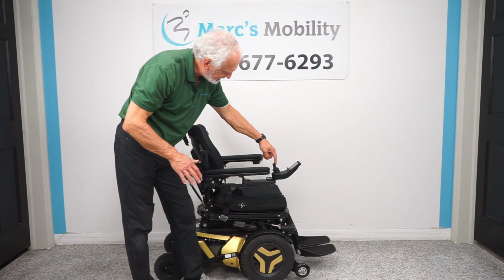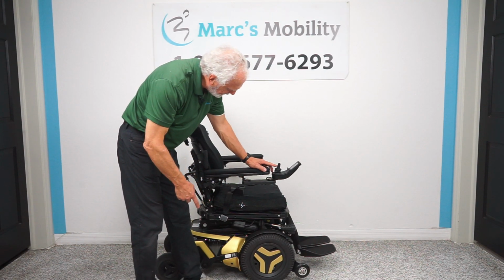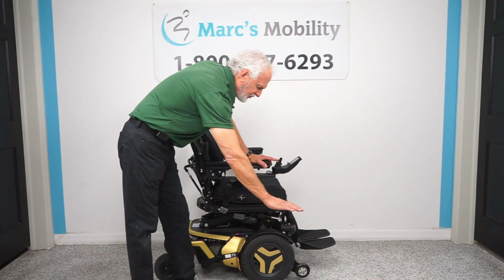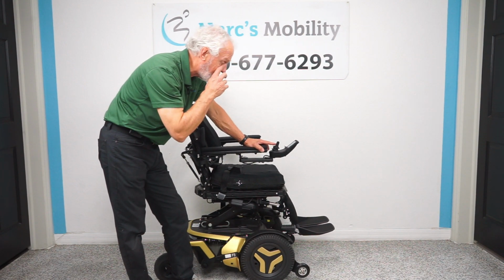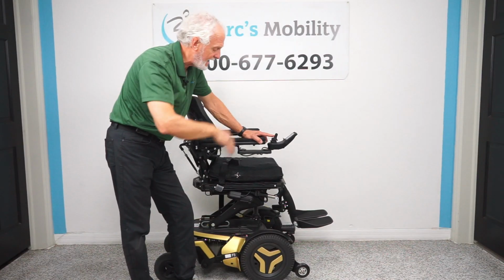So now I'm going to push it back and you'll see the seat start to go up. Well, actually it's forward. And the seat will start going up. So the seat starts at 22 inches when it's down. If you add your 12 inches, you'll be at 34 inches by the time you're all the way up. So you'll be eye level while you're driving this chair, walking with, so you'll be eye level.